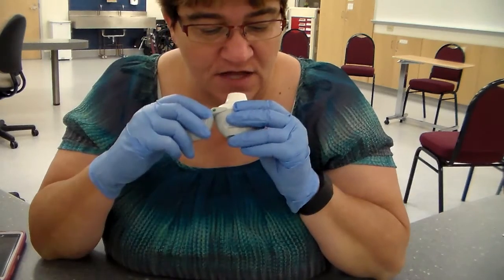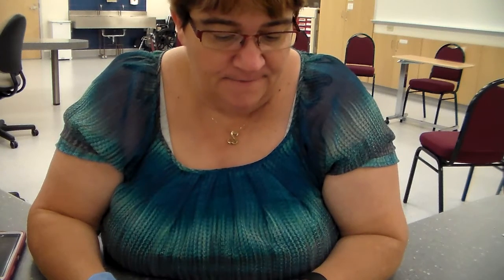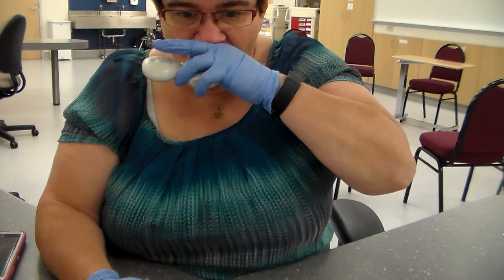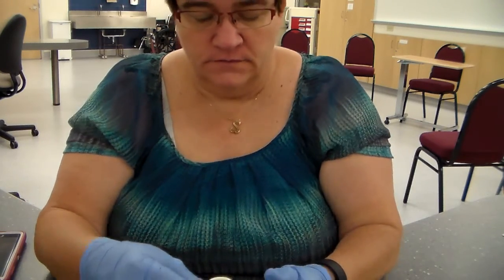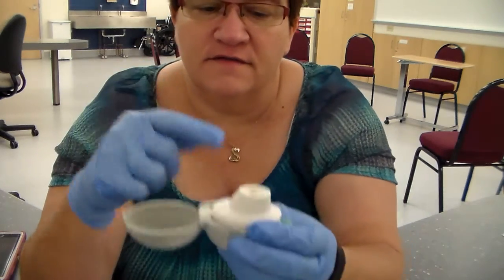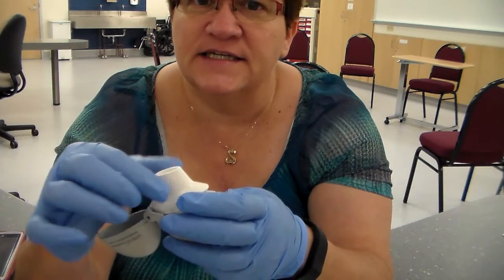Put their mouth around the mouthpiece and breathe in slowly and deeply with sufficient energy to hear the medication capsule vibrate. So I'm going to put my fingers there and try to see if I can get that to vibrate. Hold on. No, it's not. Sorry. If they breathe in slowly enough, you will hear this capsule inside hitting on it, going tick, tick, tick, tick.